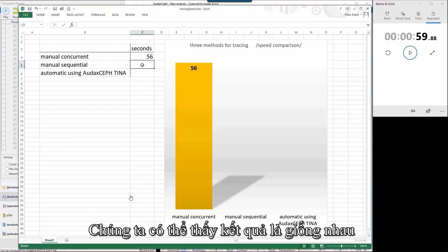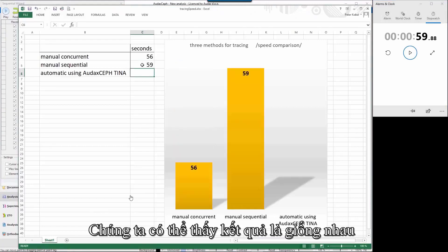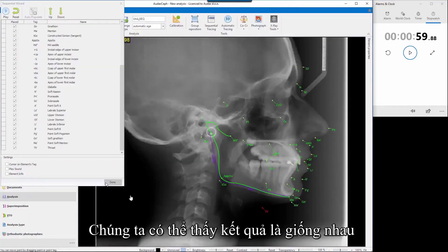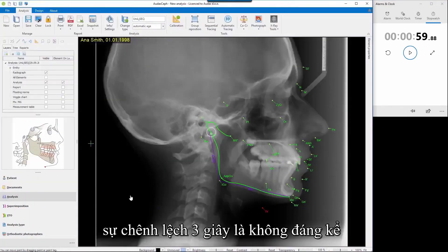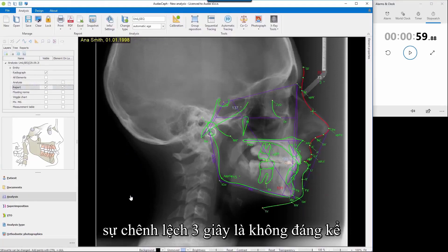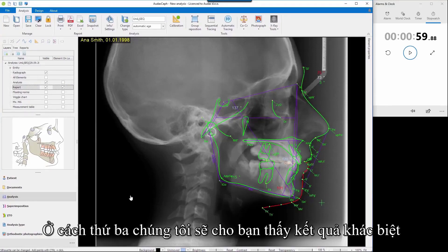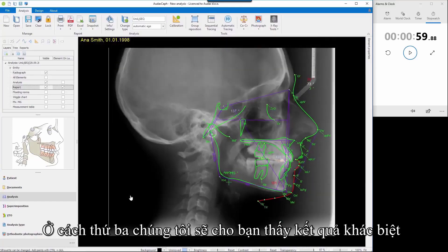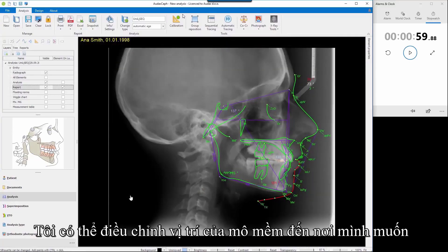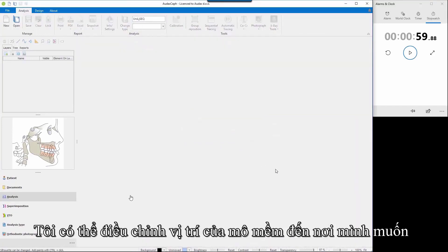It's about the same result — only three seconds difference, which is nothing. The third way I'll show right now. You can see my result and I can fine-tune soft tissue whenever I want. But now we will go to automatic tracing.